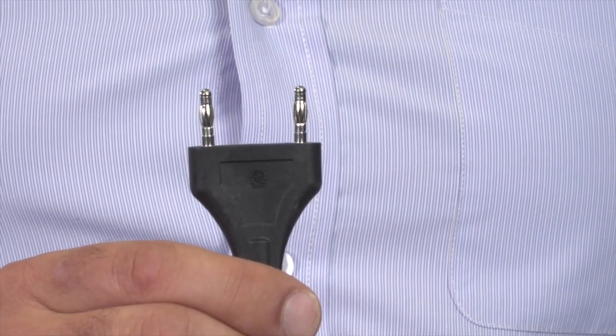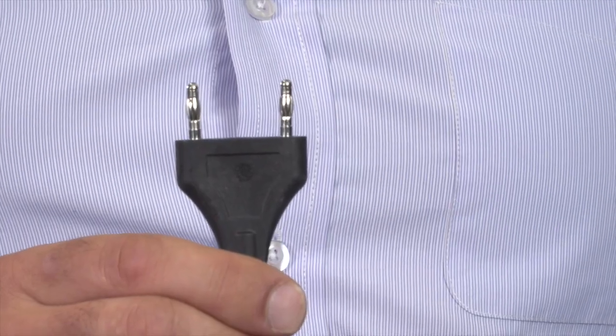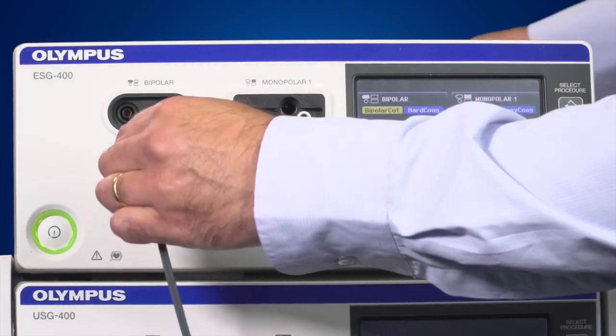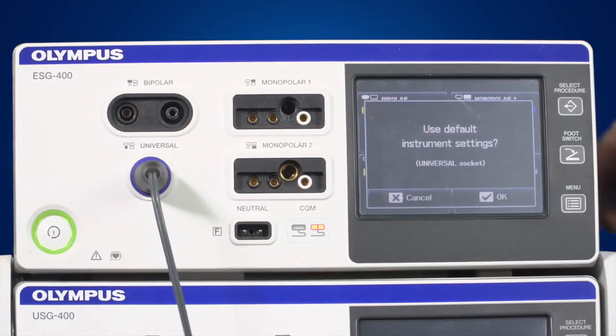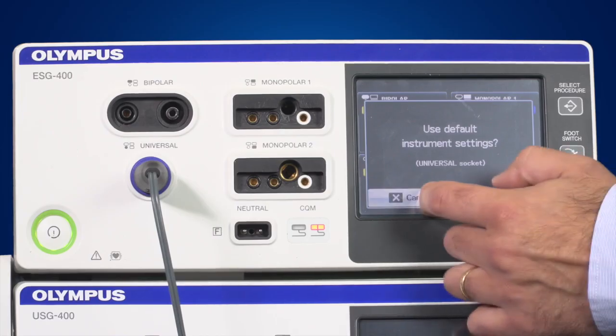Bipolar instruments have to be connected to a bipolar socket. The most common plug is the two-pin international standard plug. The universal socket powers Olympus instruments; it has instrument recognition and stores information about the instrument. When connecting an Olympus instrument, the ESG400 may ask you if you want to use the default settings. Click OK if you want to use the default settings, or click Cancel if you want to select your own settings.